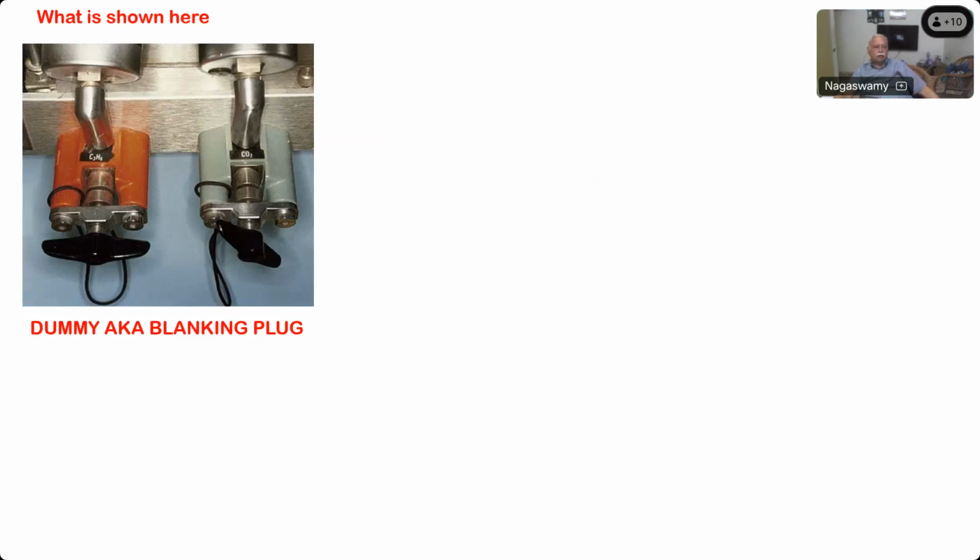And this is the color of the cylinder also. The cylinder color used to be orange like this. Orange. Not available nowadays.